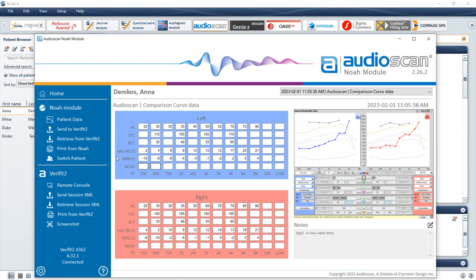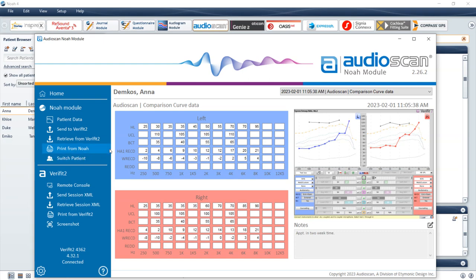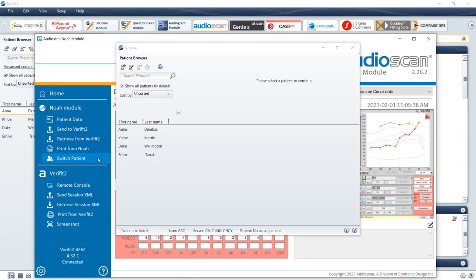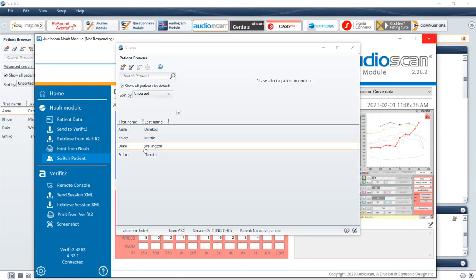To generate a NOAA module report to the office printer or save a PDF, select Print from NOAA. Switch Patients allows you to switch patients without having to leave the AudioScan NOAA module, potentially saving time between patients.